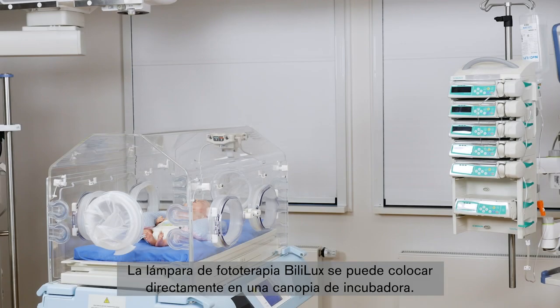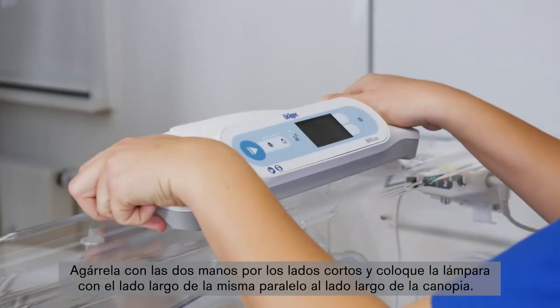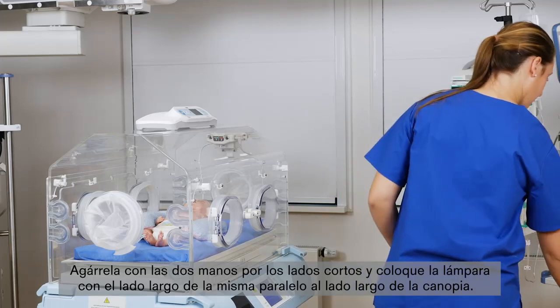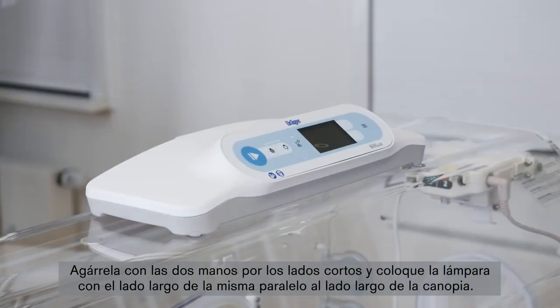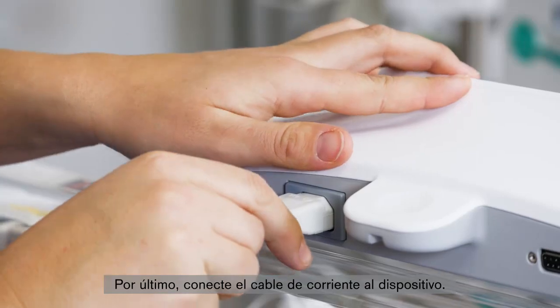The Bililux Phototherapy Light can be placed directly on an incubator hood. Grab it with two hands on the short sides and position the light with the long side parallel to the long side of the hood. The four corners of the light have slip-resistant feet on the bottom that help keep the light in place. Finally, attach the power cord to the device.